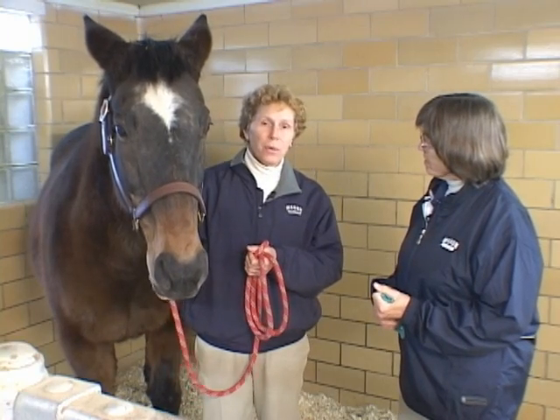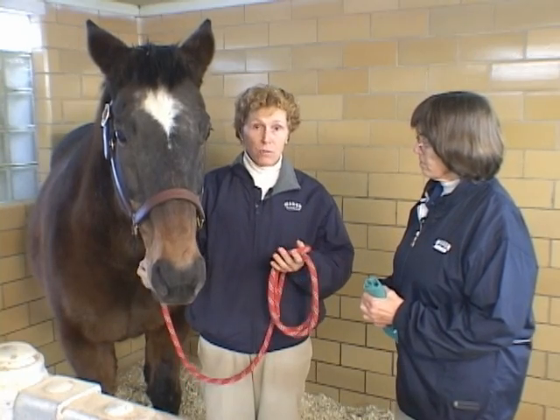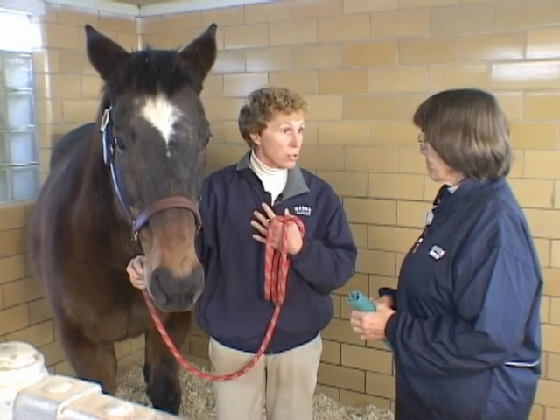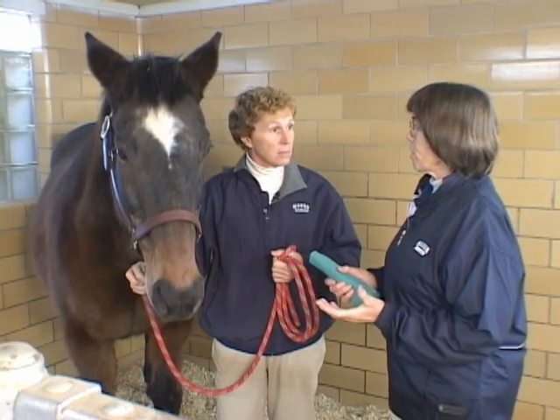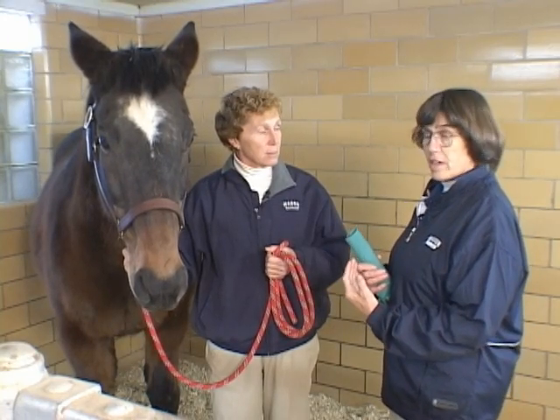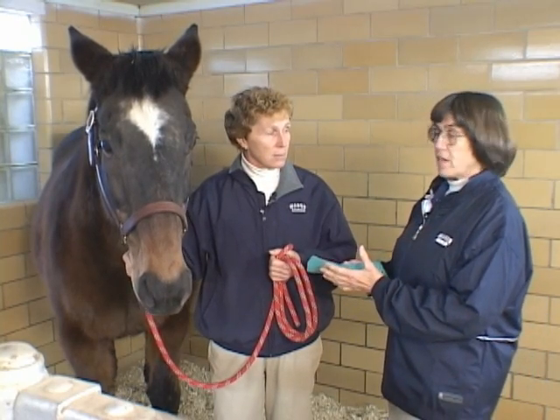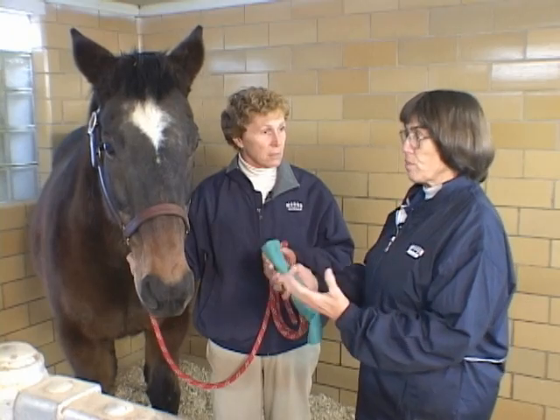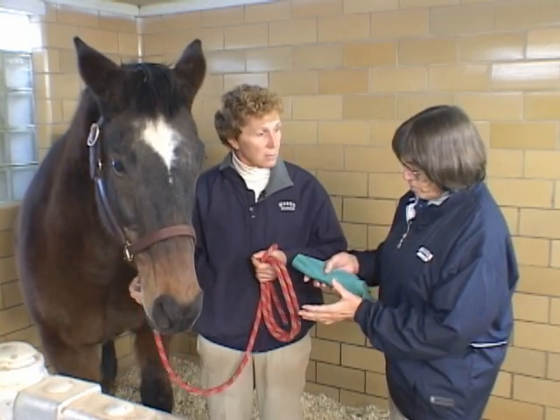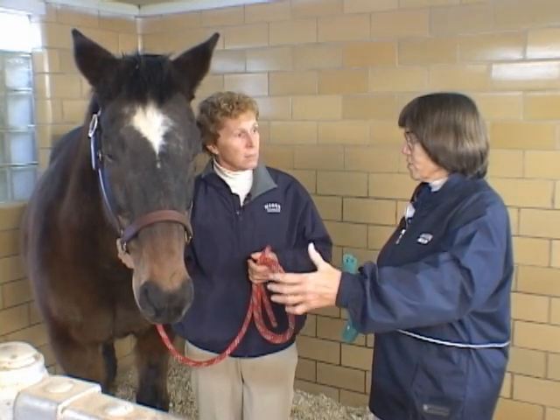From the tech's point of view, the vast majority of the time you're going to be in charge of restraint or possibly drawing up medication. We're going to demonstrate it as if I'm the tech in charge of restraint — that's just so important. Different veterinarians like to pass on different sides, but Dr. Forney and I both like to have the tech on the horse's left side and we like to be on the left side too. We're both working together, we know where each other are, and we can stay relatively out of danger back by the horse's shoulder — without somebody being on the far side if the horse is circling around us.